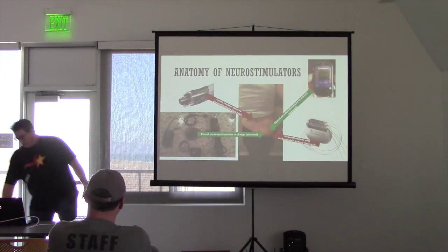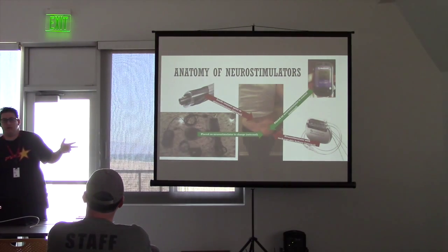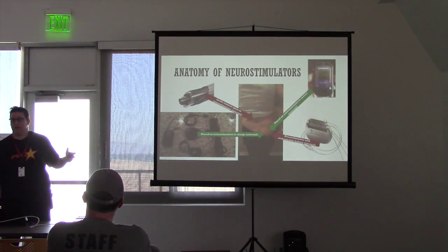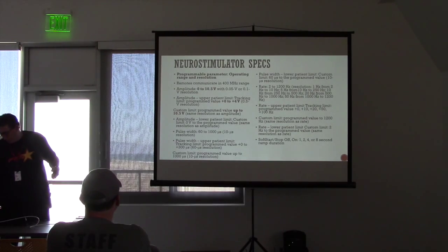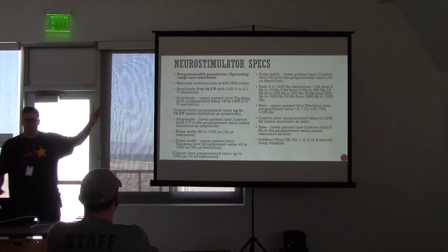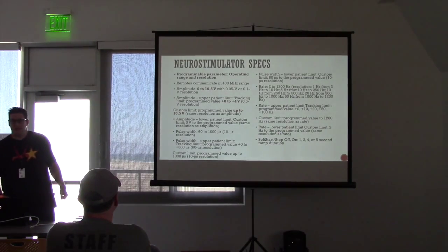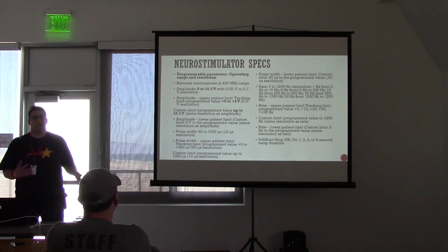So that's the device itself, and again, we're not talking about your IoT toy. We're talking about a person who needed something for quality of life. So I'm going to throw these specs up here, and I'll post this online later. Most of this is TLDR. But basically, the things I've highlighted in red, let's talk about power for a minute.